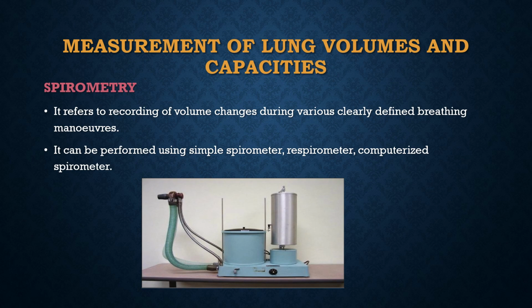The measurement of lung volumes and capacities: we have seen the definition and values of these volumes and capacities. Now we'll see the method of recording or measuring these volumes and capacities. It is by using a simple spirometer. Here we can see a simple spirometer, and there are also other spirometers like the respirometer, which is a modified spirometer, and the computerized spirometer.